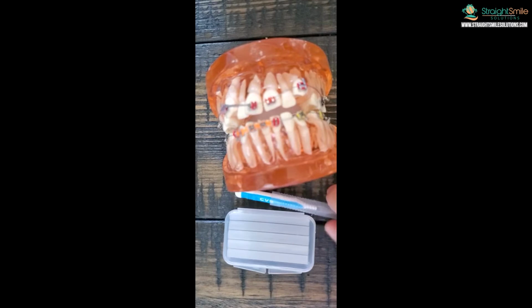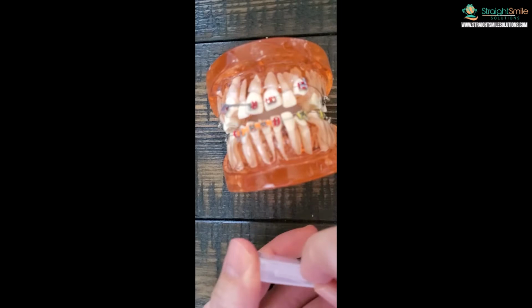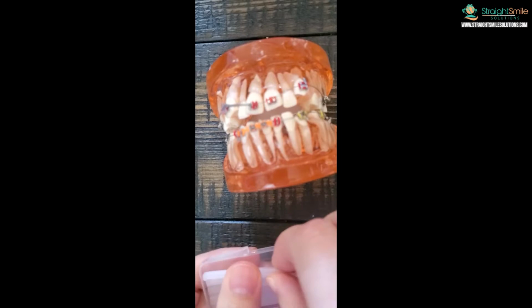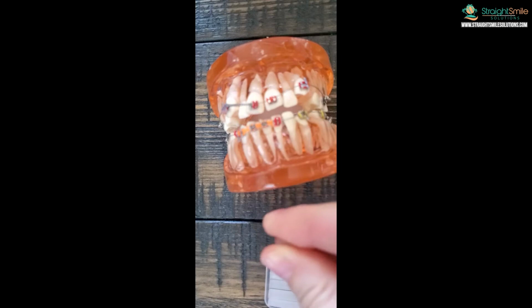This stuff will melt if you leave it in a hot car or hot backpack in the sun. So you need a lot of them, like a lot. And possibly the first couple weeks, you might use many of these. So I would just have them ready to go. Open it up. It comes in these strips. Take a size off about the size of a little pea. Heat it up, mush it up. Make it the size of a tiny little itty bitty pea or like a corn kernel. Like that, okay? And just press it on whatever's bothering you.